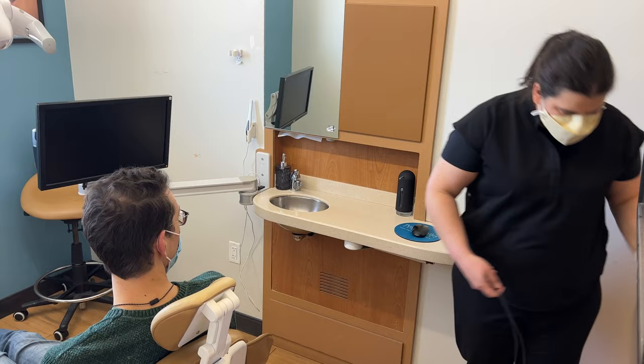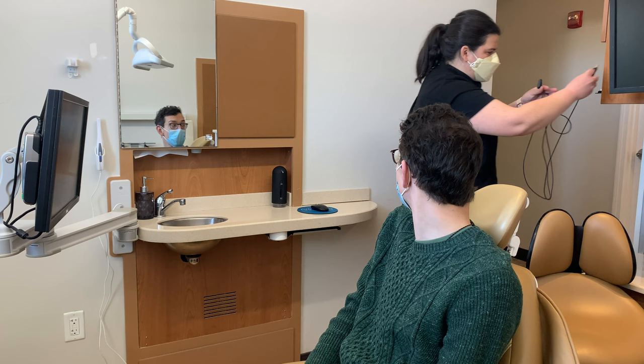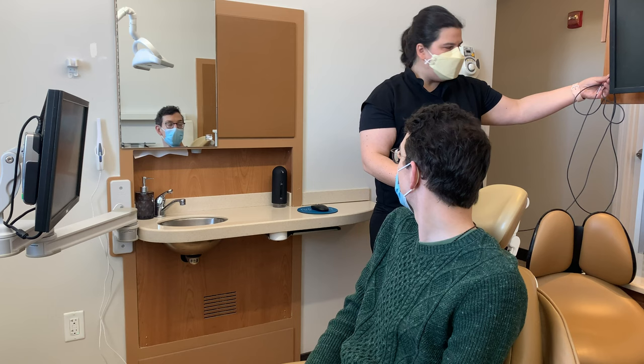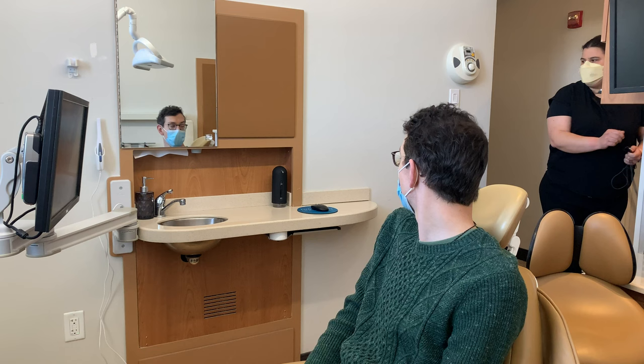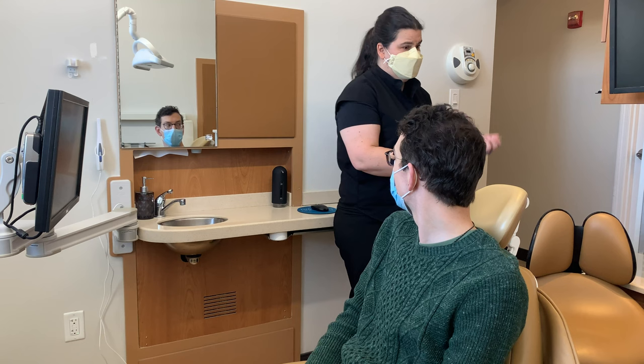Another option is to have it plugged in the back with the same idea — if it's plugged here, I can adjust it as needed while taking films in the room, whether for left-hand or right-hand use. I can leave the room, grab my handheld, take my image, position my handheld, and walk out never having to hop over a cord. That's a big thing — it's safety for the practitioners too.